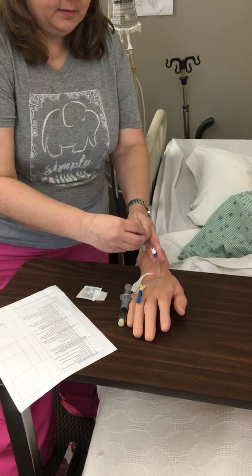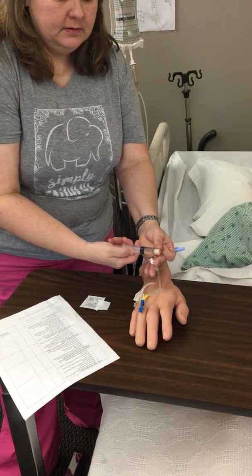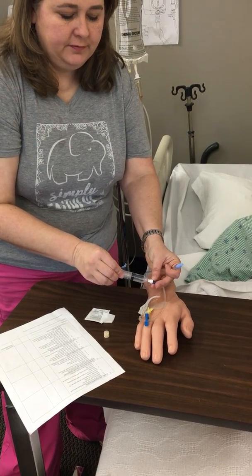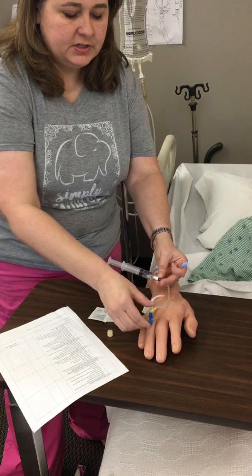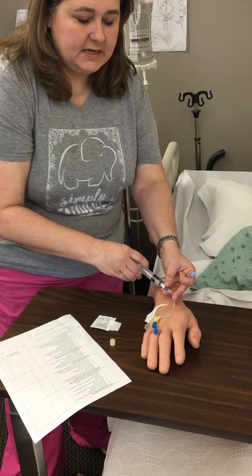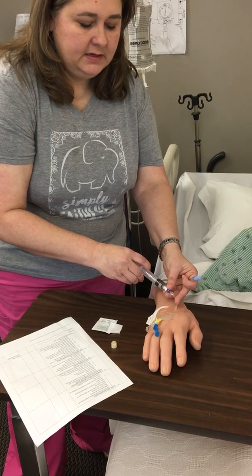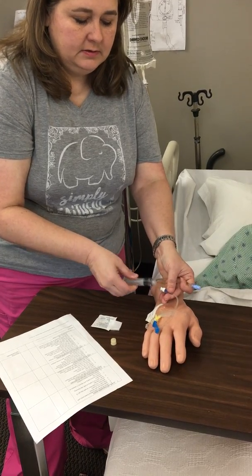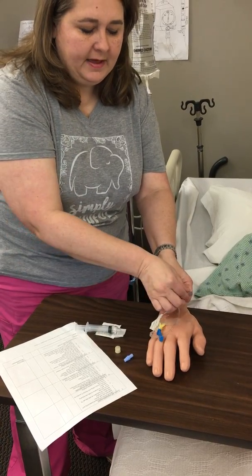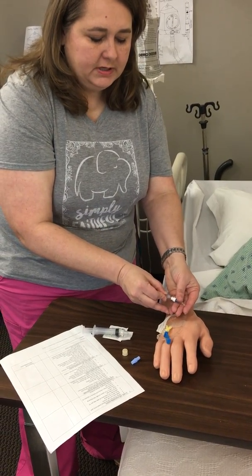Whoops, I'm sorry. Back up one step. I need to flush at this point. So I've removed my cap. I'm going to flush with 2.5 milliliters of flush. Unclamp my extension set. I'm going to flush with a smooth and steady flush here with my saline, 2.5 milliliters. I'm going to lay that right on my alcohol. Now let's uncap that tubing, and we're going to connect here.